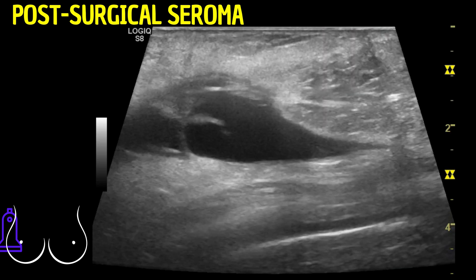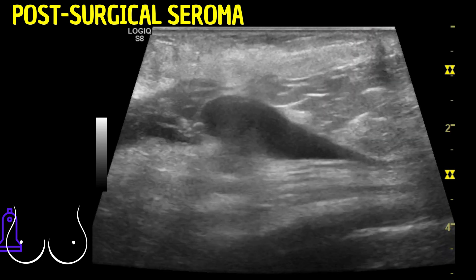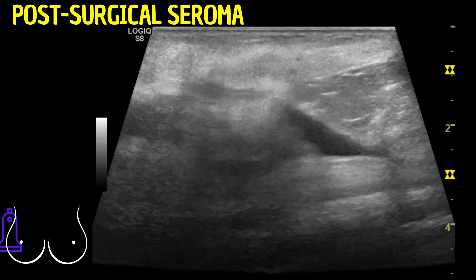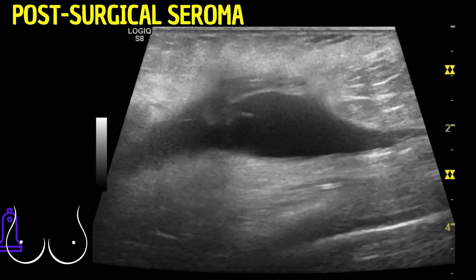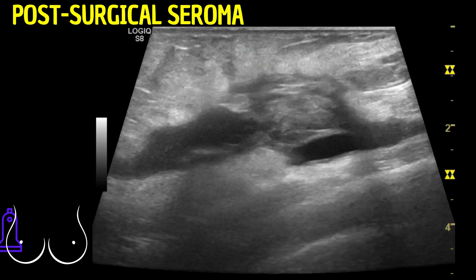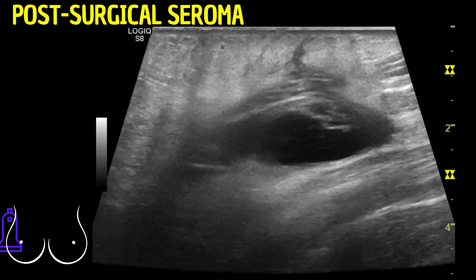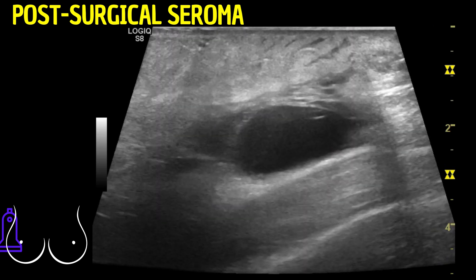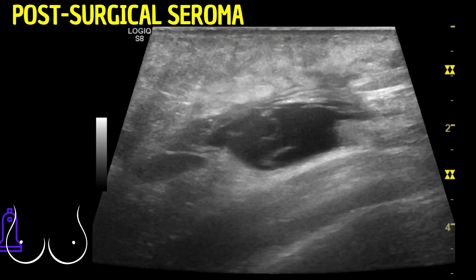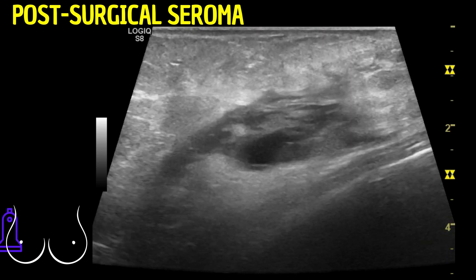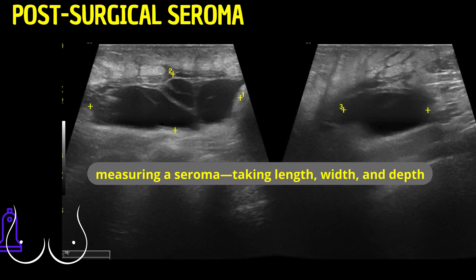Accurately measuring a seroma — taking length, width, and depth — is essential for calculating its volume for the medical report. The distance from the skin to the seroma should also be noted, assisting in potential interventions.